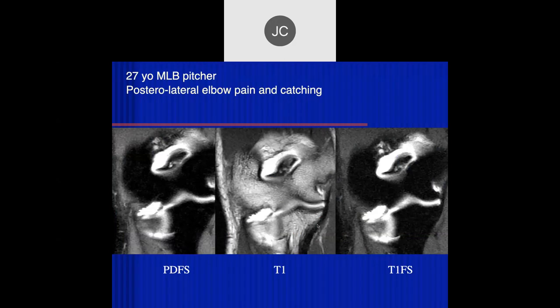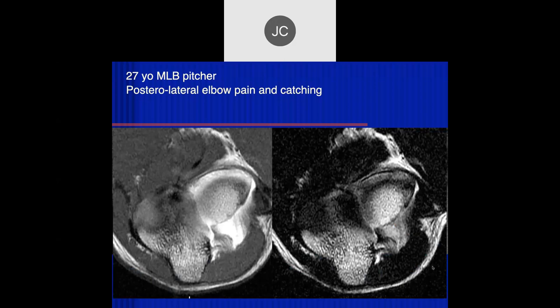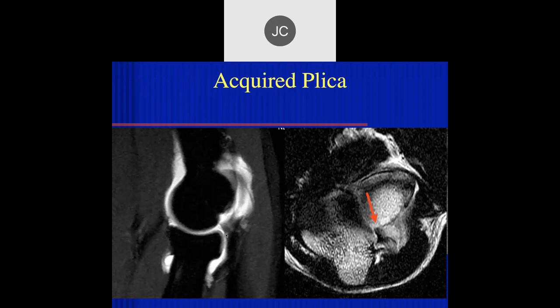Here's a patient with lateral elbow pain and catching. At the radiocapitellar joint there might be some abnormal soft tissue within the joint space. On the axial images we can see it running through here. This was thought to be an acquired plica - they did arthroscopy, removed it, and the symptoms went away. So it can be real.